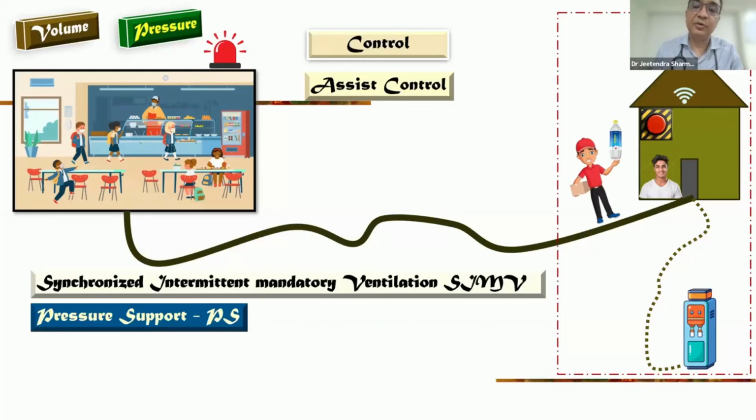Okay. Now, to understand the newer things, triggering is by pressure, because you need to press the button so that whenever there is a change in the pressure in the airway, it triggers the breath. And where does triggering come in? Assist control has the triggering action, SIMV has triggering, pressure support also has triggering. But all these things, now I'm talking about just the triggering mechanism.